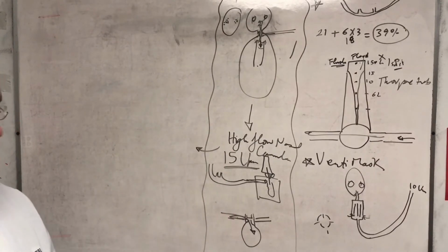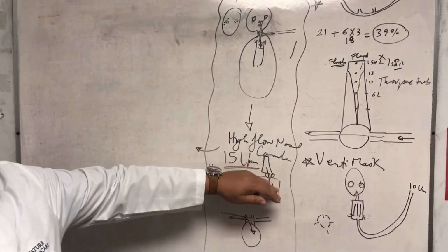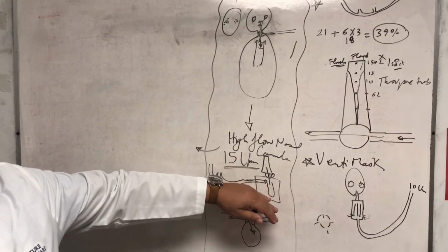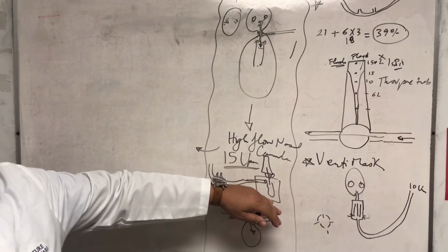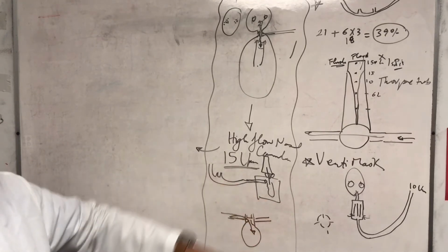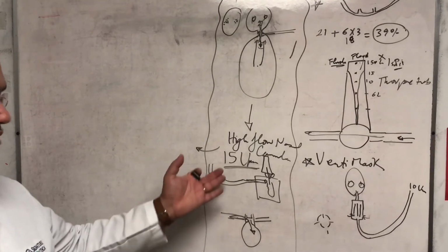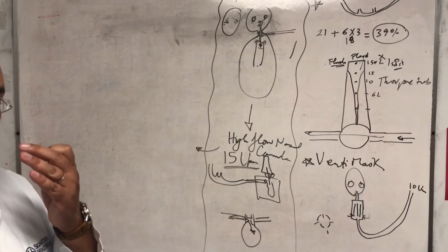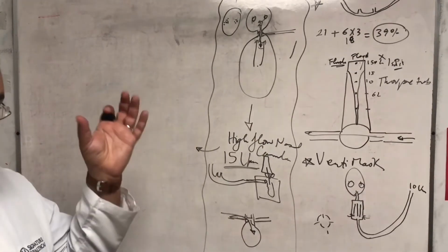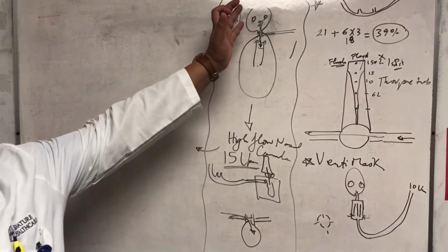But hospitals that have the high flow nasal cannula got a recommendation from the CDC saying you can't use it. What they mean is the heated wire high flow nasal cannula, not the high flow nasal cannula, because as we talked about before, normal patients breathe about 10 to 20 liters per minute. So if I'm giving them 15 liters per minute, the dispersion outside their nose is going to be limited. It's not going to be more than 6 feet.